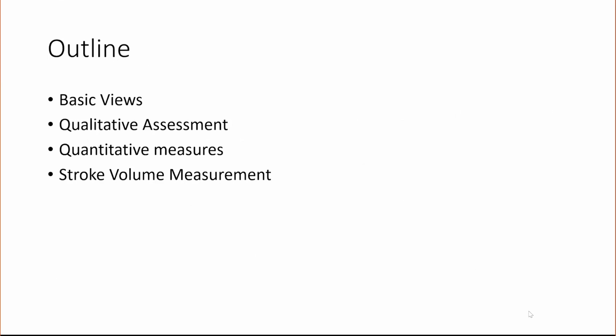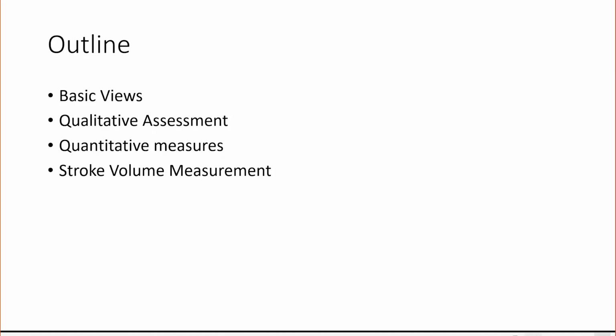One disclaimer I have is that although I'm a pediatric intensivist, I have training in cardiac ICU. Most of what I learned about echo or POCUS is from adult courses, and as my preparation for the critical care echo board. So some of my presentation has an adult training bias, and there are subtle differences between adult POCUS and pediatric echo, which I will explain as we go along.